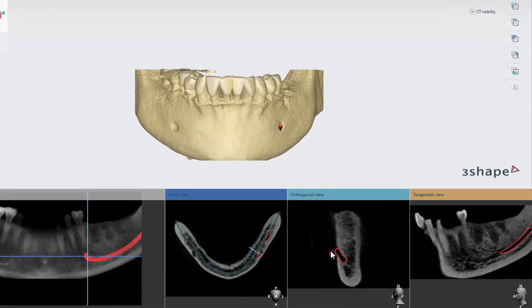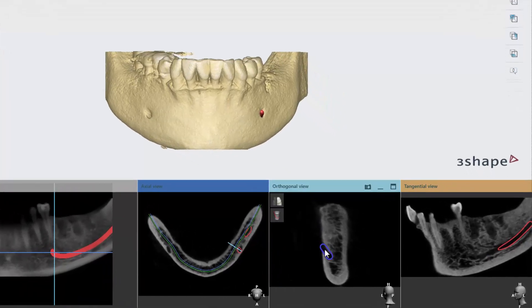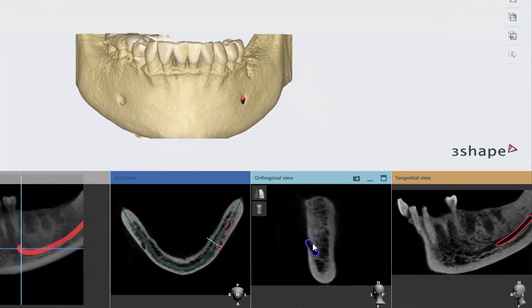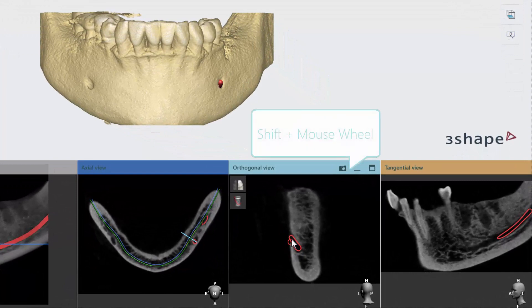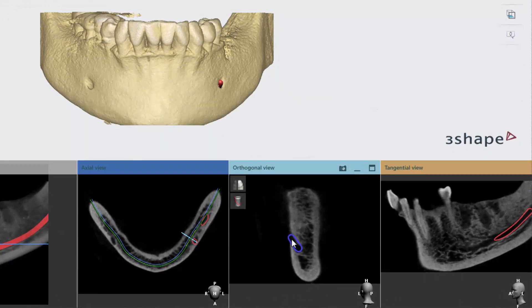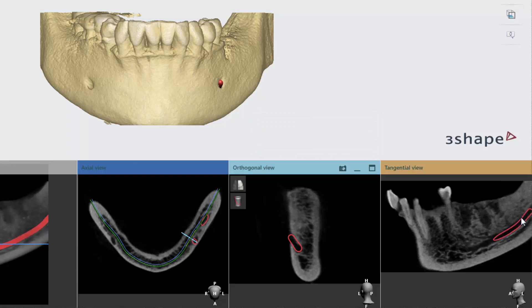You can also adjust the nerve by moving the mouse over the nerve — it will then change from red to blue, and with the cursor you can move the nerve. To remove the nerve and start over, click on the bin icon.